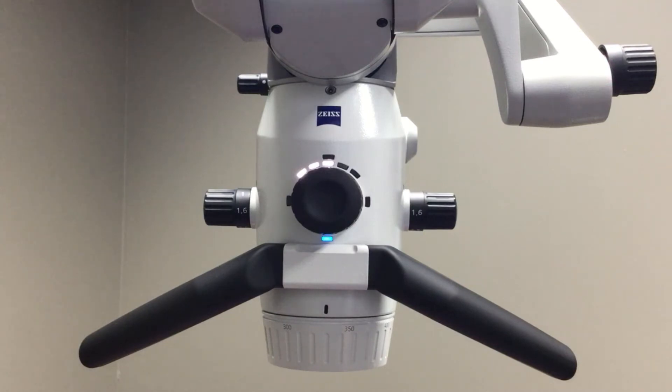The fluorescence mode serves a couple of really great functions for the operator. The first is that when it illuminates the tooth structure it can help with the identification of bacteria and possible carious areas on the tooth structure, but it also illuminates tooth structure and composites differently.